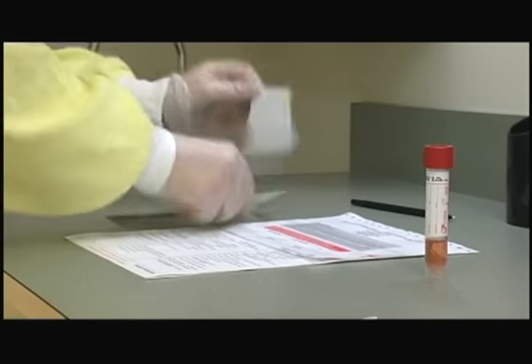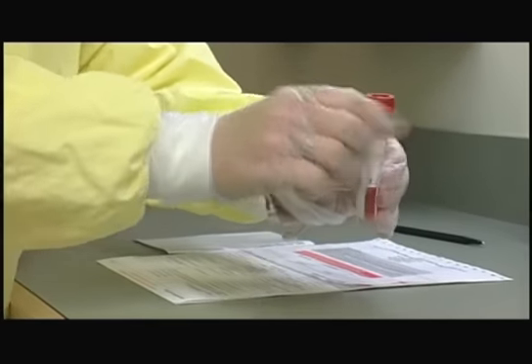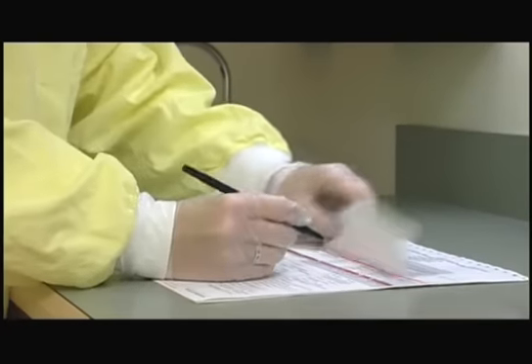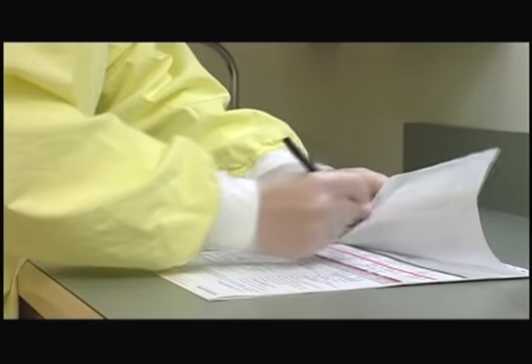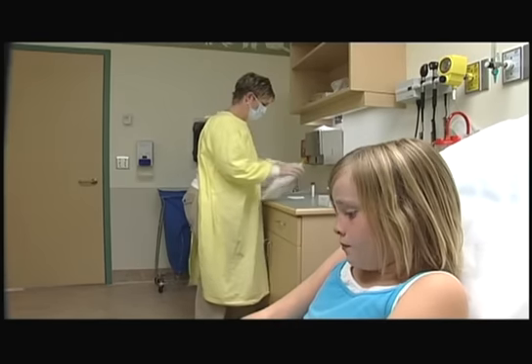The collection tubes should be labeled either prior to or immediately after collecting the sample so that you avoid patient mix-ups and incorrect labeling, especially when collecting multiple samples from the same or different patients.